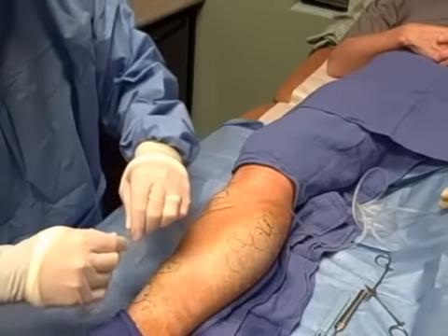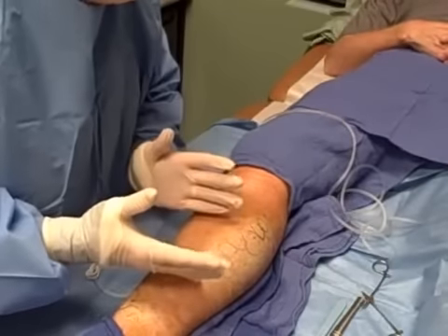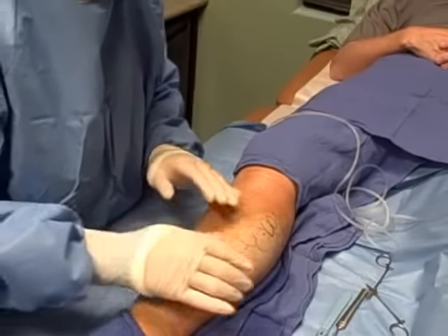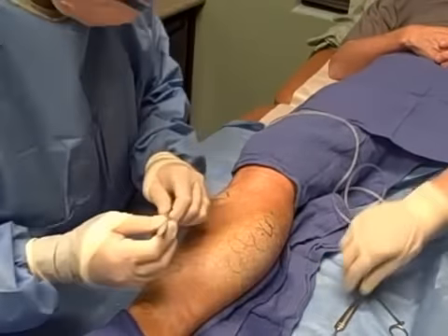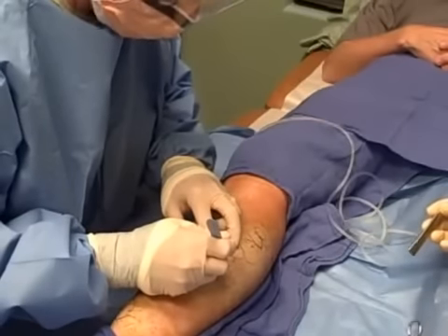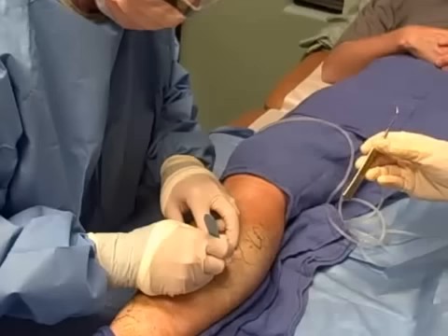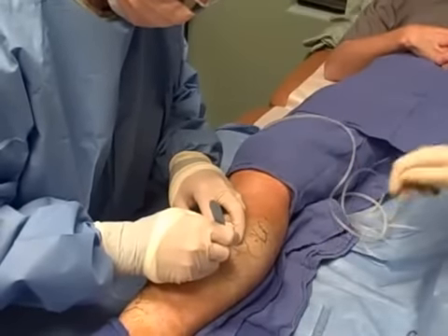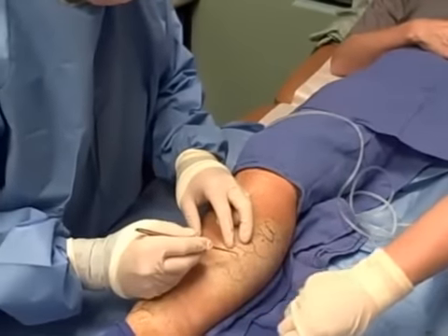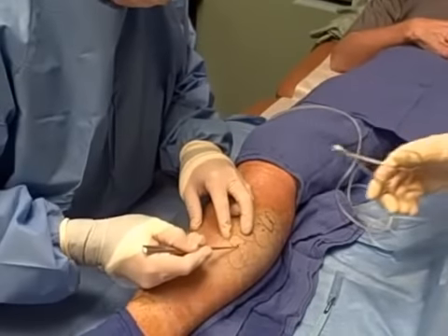The next thing we do is we need to make a little incision. There are lines that your skin runs in, and we want to make sure that we make the incision in the same direction as those lines, so it really minimizes any chance of scarring. We check for those lines and then make a little incision. I'll ask the patient — do you feel this at all? No, he does not feel that. A very tiny incision, and then we just have this crochet hook and we're going to go inside and find the vein.